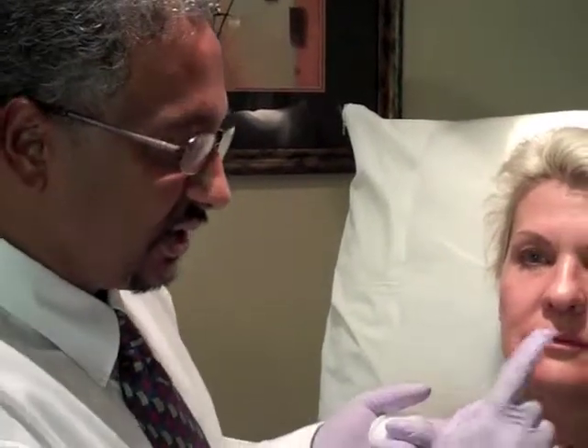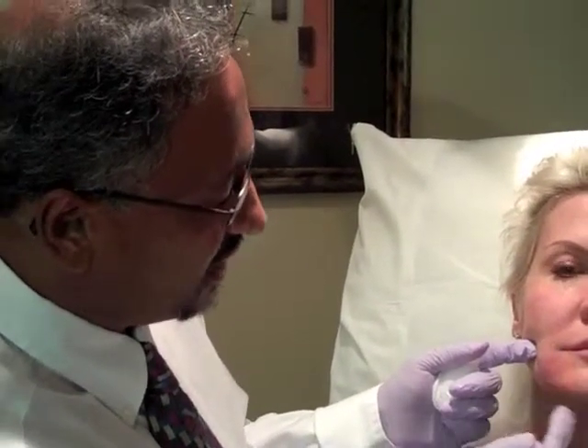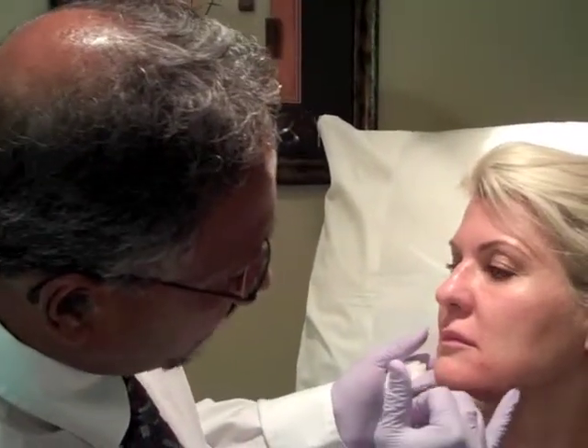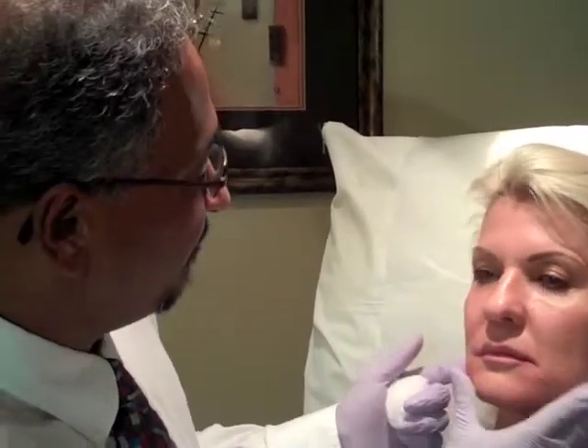Off camera I've just done the other side and you can see the result here. This is all cleared up, with a nice straight line in the apple jowl here. Likewise, she's got a nice straight line here and this marionette line is almost completely cleared up and faded away.